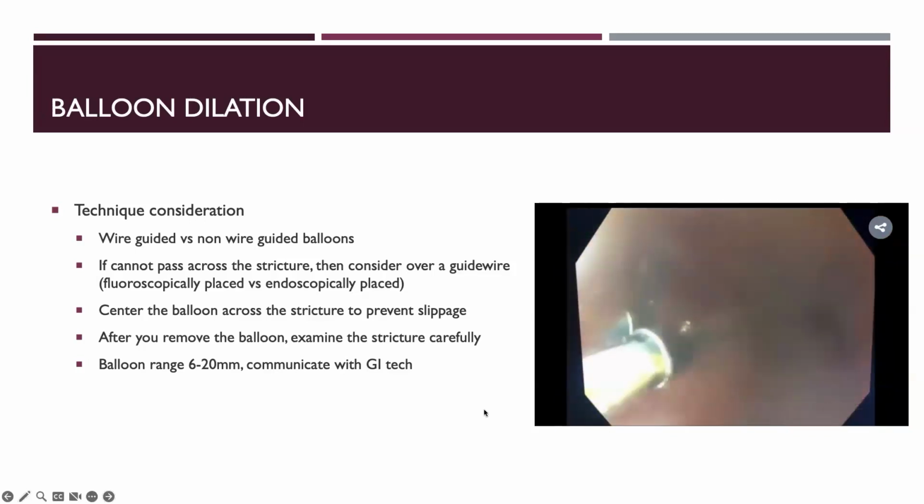And if you have a small wire perforation across a malignant stricture, and that's all you've done, and you've confirmed on fluoroscopy, hey, I'm no longer in the lumen, you didn't do too much wrong there. The wire is so small: pull back the wire, image them again, make sure, give them some antibiotics. Innately, they're probably going to do okay. But the risk here really is if you believed your wire location and then you dilated across. So now you've just created a very bad perforation in a potentially malignant stricture.